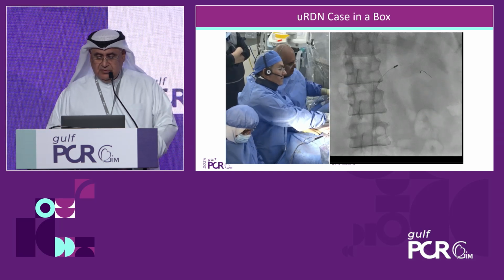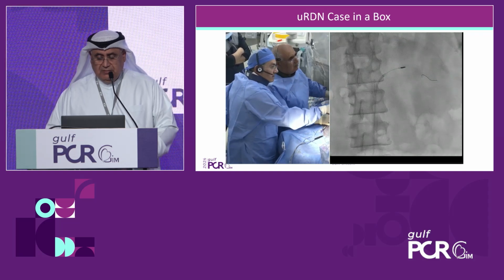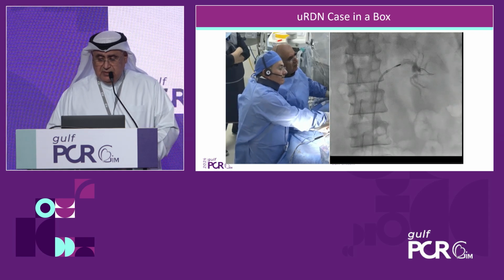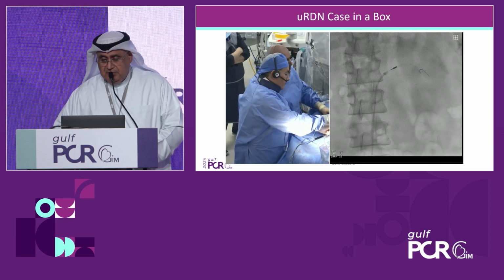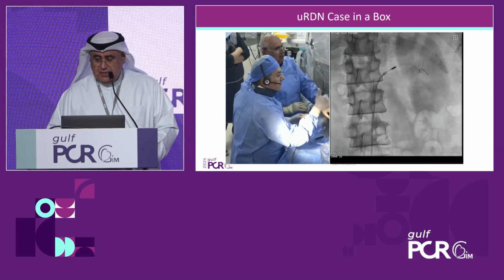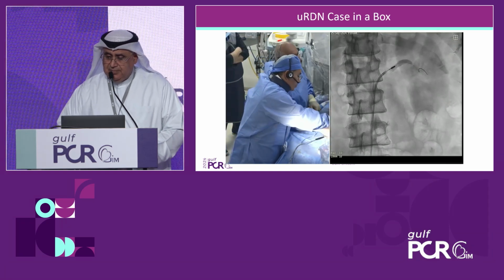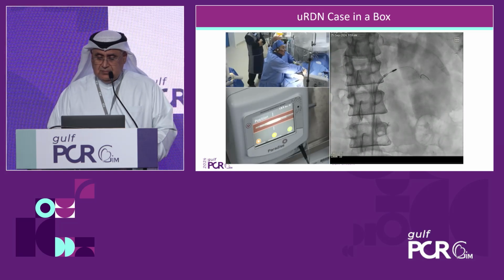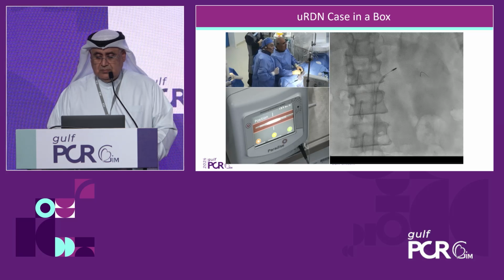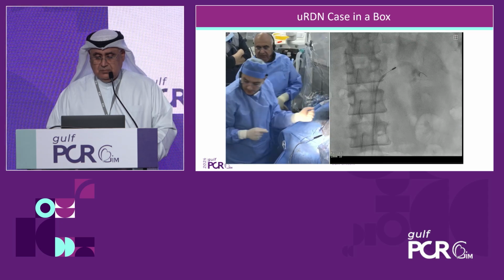Now we moved proximally for the second inflation. We have to keep distance from the origin of the right renal artery. We should not be touching the ostium, keeping at least 5 millimeter distance. Mild stenosis shouldn't be a problem, but there shouldn't be a moderate or severe stenosis at the area of the energy delivery. One transducer away from the ostium of the renal artery, and maybe just a bit. Yes. This may be better. Yeah. Perfect. Okay. Can we save that one, please?